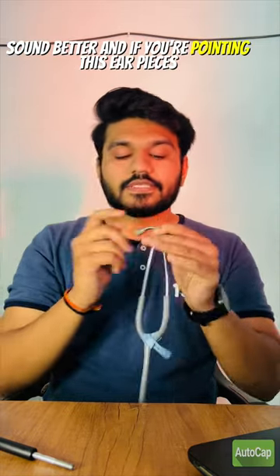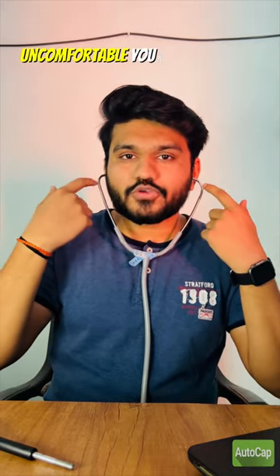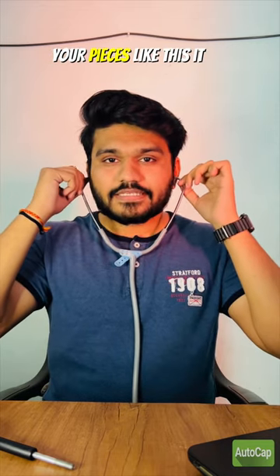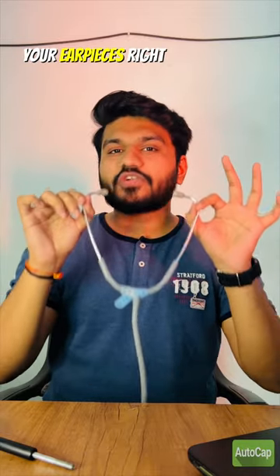If you are pointing these earpieces to the back, you cannot hear the heart sounds, and it is also too uncomfortable. You cannot put the earpieces like this — it will be too uncomfortable and you cannot even hear the sound. So make sure you put your earpieces right.